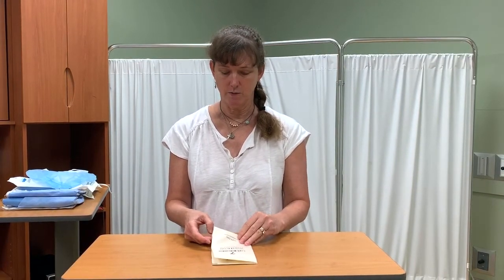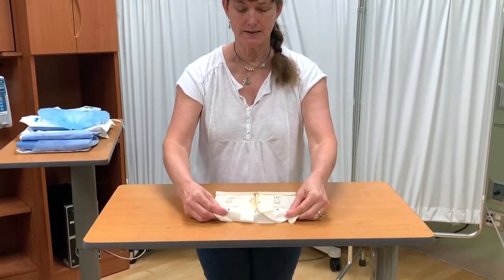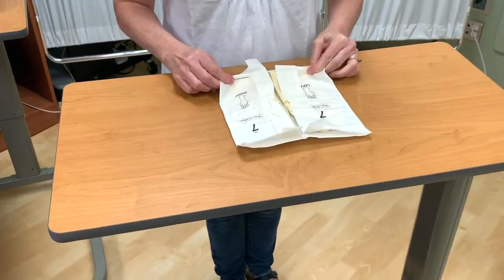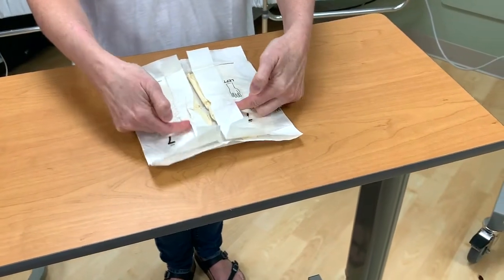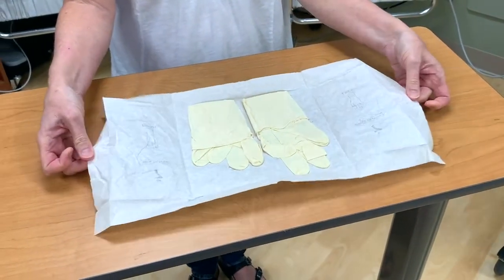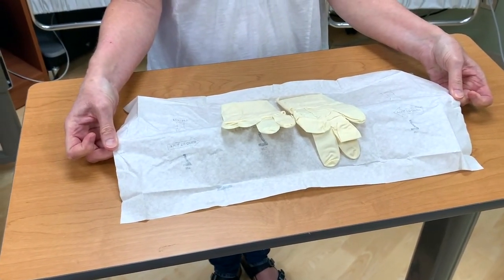Remember that your glove size is approximately your shoe size, and that's a way to figure out what size you wear. So I'm going to fold them open. Now these actually seem like they're steam ironed in there, and so these creases are very solid. Okay, and remember here's that 1 inch margin that we were talking about. I'm going to pull this a little tight here so that it doesn't flip back.